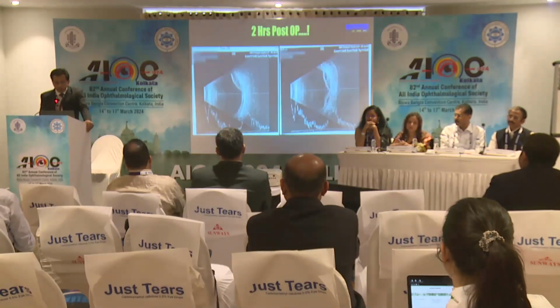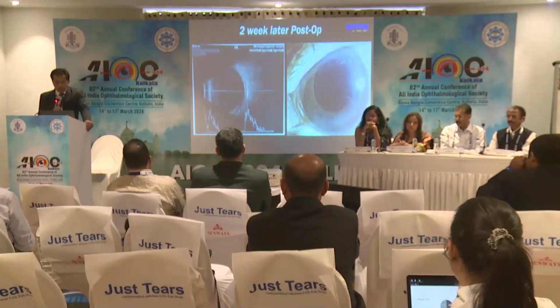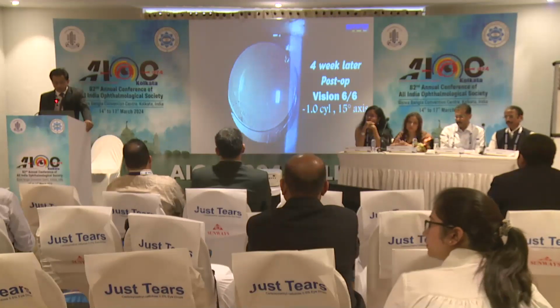The central scan was normal. When we did peripheral scans, we could see these choroidal mounds with hemorrhage there. And this was an eye-opener for us. Just a conservative approach did clear it up, and I was extremely lucky, I should say.